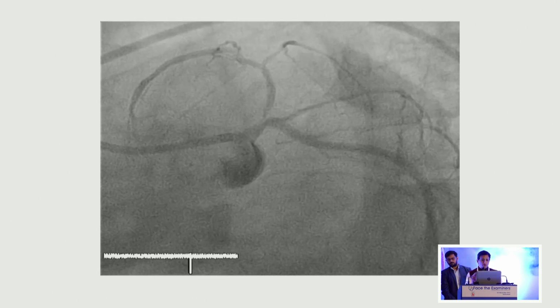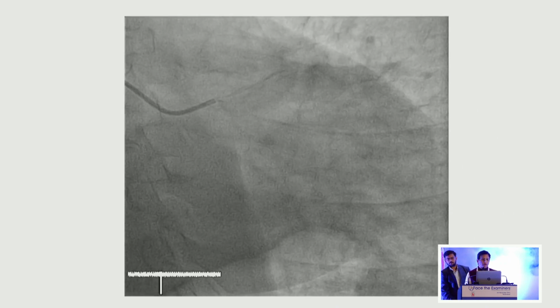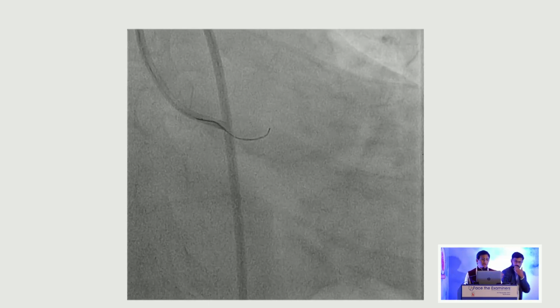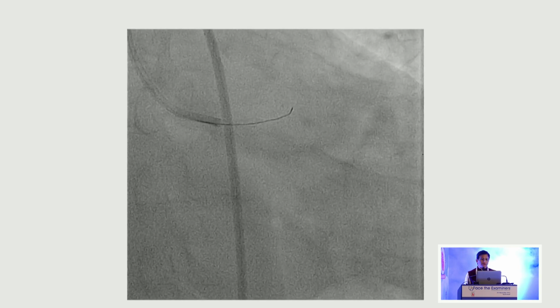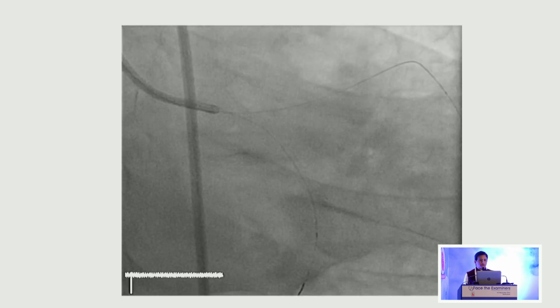Unfortunately I could not show you, but that would have been a nightmare to enter. I used another wire initially, but finally this was a simple Whisper wire which easily went through, and that's how I could get it. And you can see at the beginning that I made all those bends in that. Okay, so this is what it is.